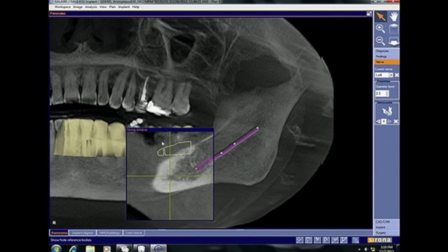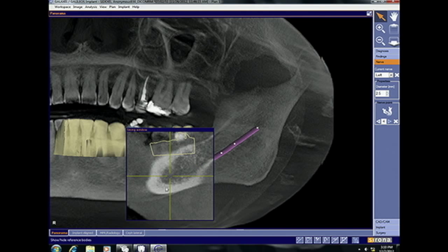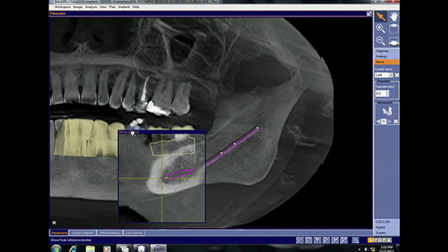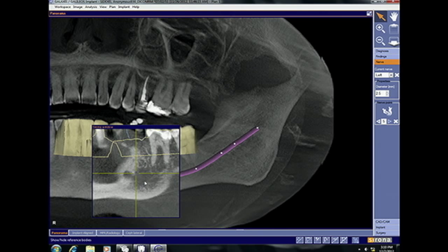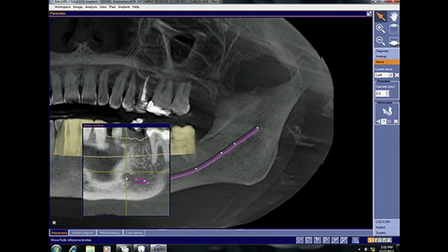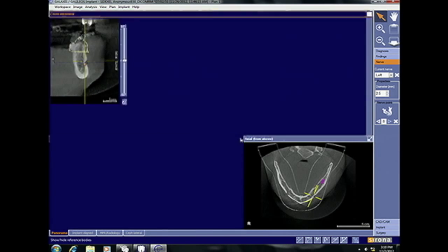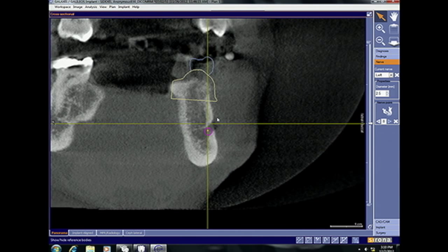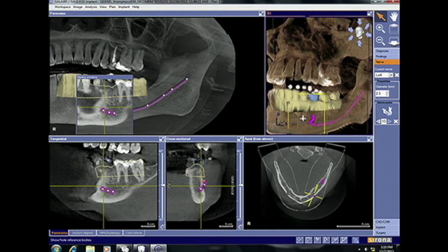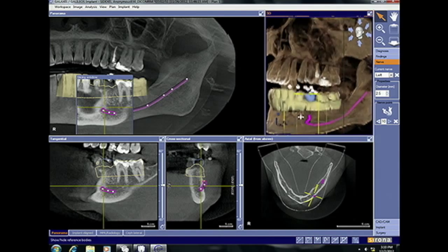I'm going to take my time, especially when we get close to looking at where the nerve is in relationship to site number 20. As I got close to the mental foramen, I sometimes like to switch modes — get out of the panorama mode and look at the cross-sectional mode to observe where that nerve actually exits the mandible through the mental foramen. Very quickly, I have essentially mapped the nerve, as you can see here in the 3D model.